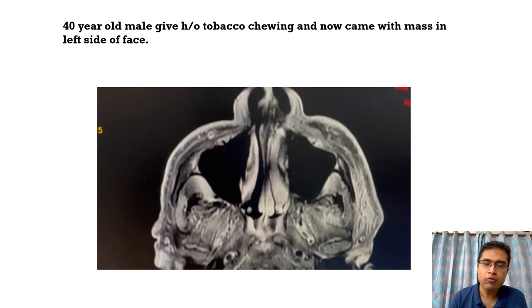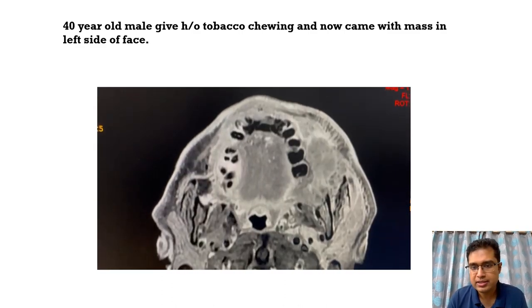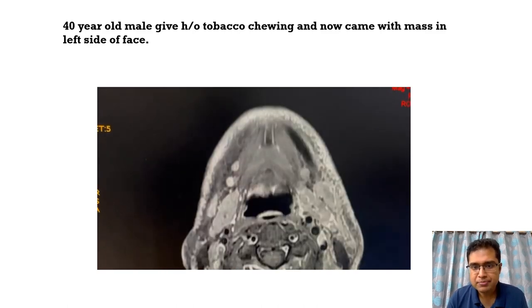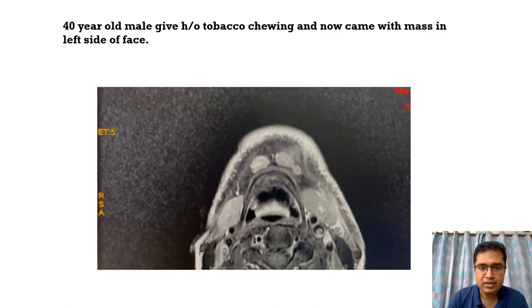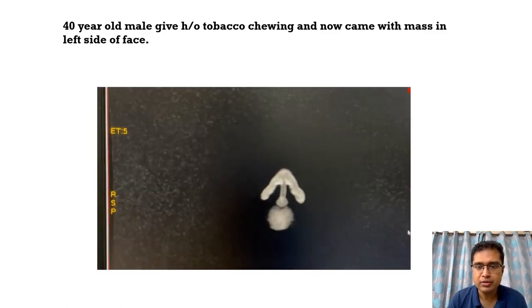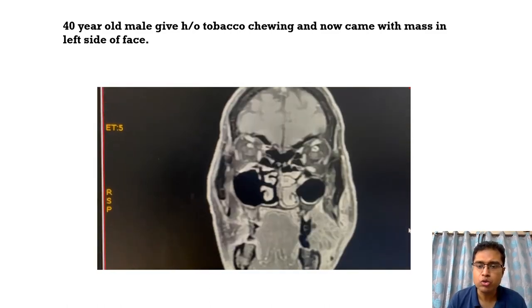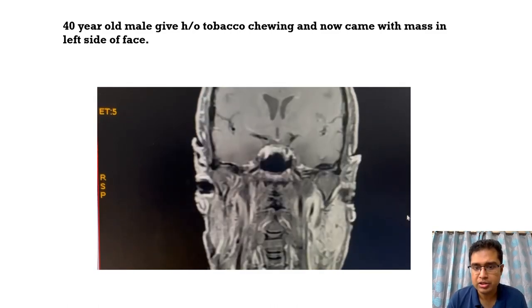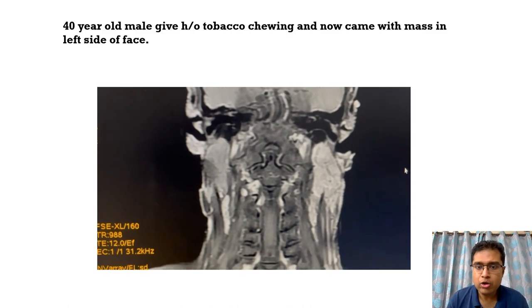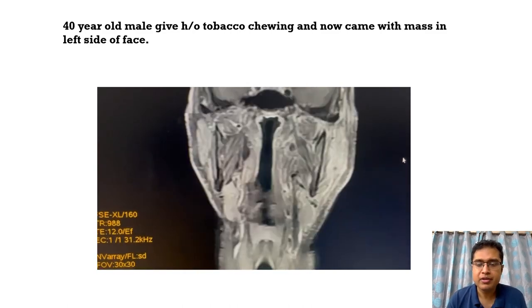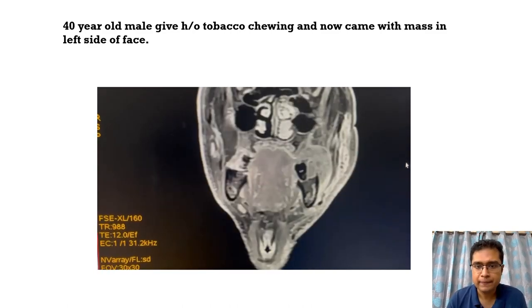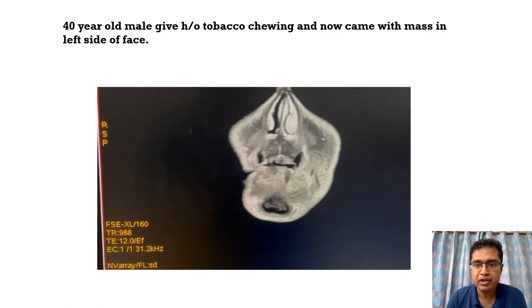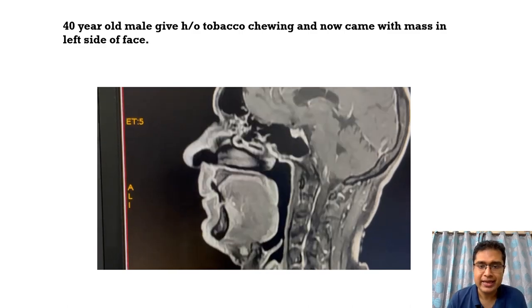The mass definitely involves the gingivobuccal sulcus, but the epicenter is in the retromolar trigone. The masticator space is also involved, and there are some nodes in the submental region. On the T1 post-contrast coronal images, we can see this heterogeneously enhancing mass region, and the craniocaudal extent is very well determined — extending up to the inferior wall of the left maxillary sinus.